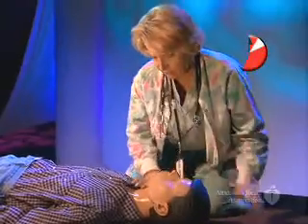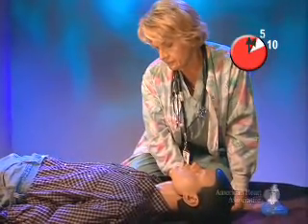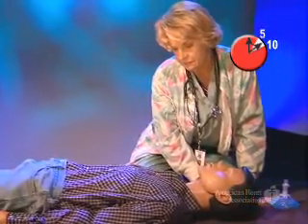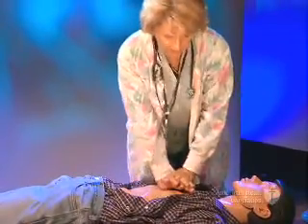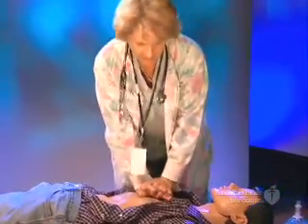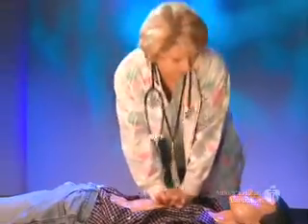Check for a pulse, and if you do not definitely feel one within 5 to 10 seconds, quickly move or remove the clothes from the front of the chest that will get in the way of providing chest compressions and apply the AED pads. Provide cycles of 30 chest compressions and 2 breaths, and use the AED when it is available.